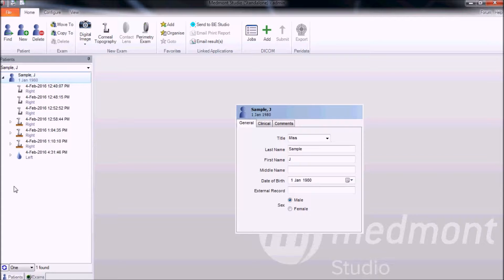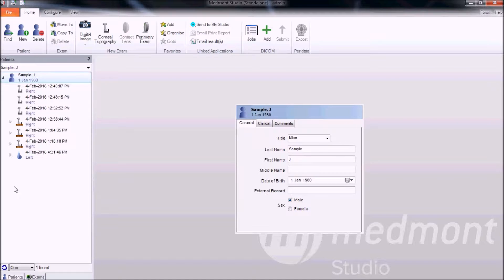This video covers tear film analysis using the Medmont E300 corneal topographer. It helps you assess the patient's dry eye by quantifying and qualifying the degree of tear film breakup evident in the reflection of the placido disc.